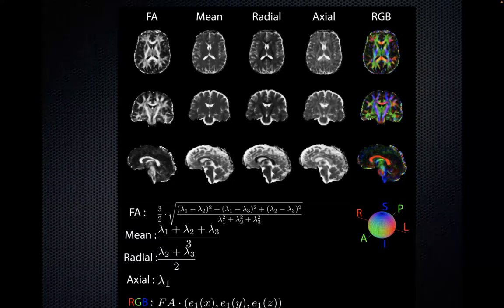And as a bonus, we go back to our diffusivities. These mean radial axial diffusivity, I should have put units here, but these are in millimeters squared per second. These are speed. This is the speed at which the diffusion of water molecule in the voxel diffuses in the axial direction or the perpendicular direction. You see the equation right here? Perpendicular is radial, lambda 2 plus lambda 3 divided by 2. It's the average speed of water molecules perpendicular to the axons.